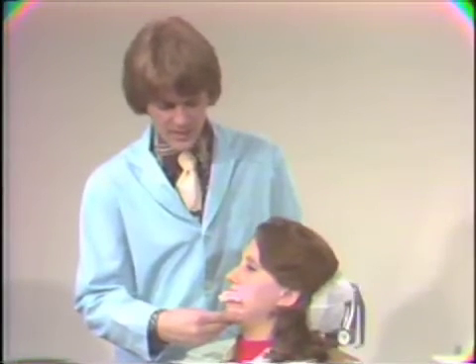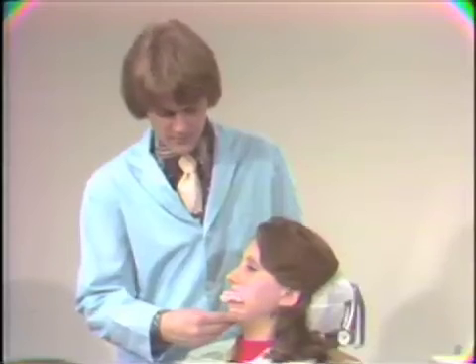Now we continue this process, forward, back, to the right, back, to the left, back, until our acrylic is set. Okay, now once the acrylic is set, we'll go ahead, take them out of the mouth, and we'll relieve these stereographic recordings just so the clutches are just minimally out of contact.